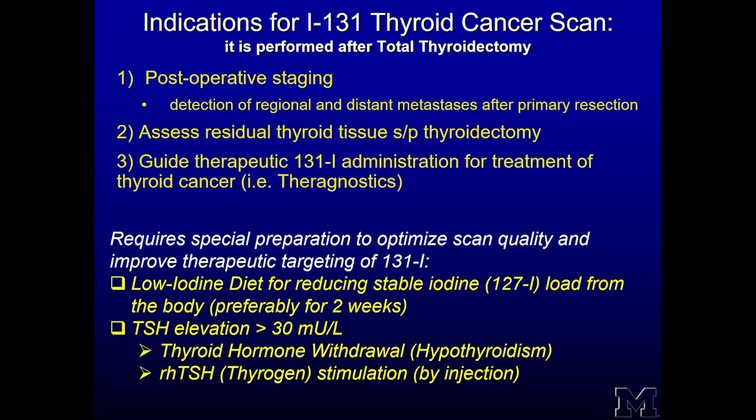It's the blending of the concept of diagnostic and therapeutics as outlined in the word theranostics, which is therapeutics guided by diagnostic imaging performed with the same isotope. The iodine-131 scan requires special preparation to optimize scan quality and improve therapeutic targeting of iodine-131.